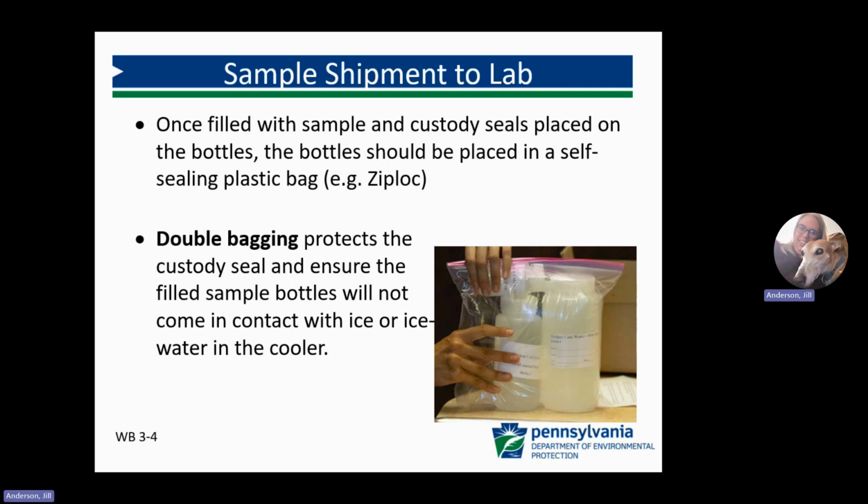Use custody seals provided by the laboratory. Double bagging the samples will protect the custody seal and ensure that the filled sample bottles will not come in contact with ice or ice water in the cooler.